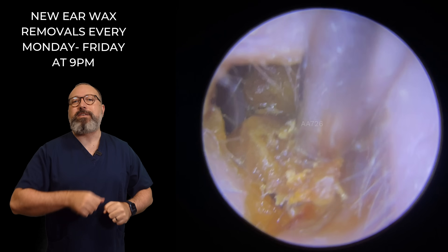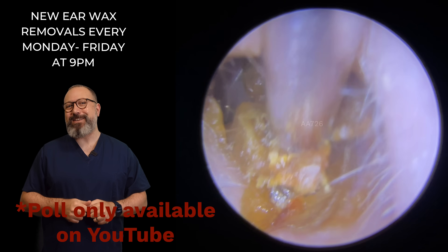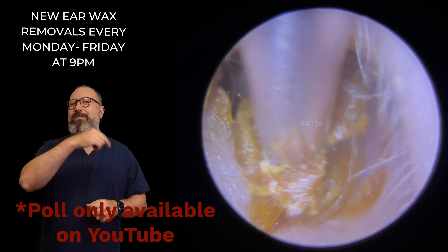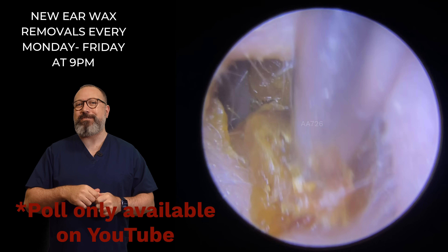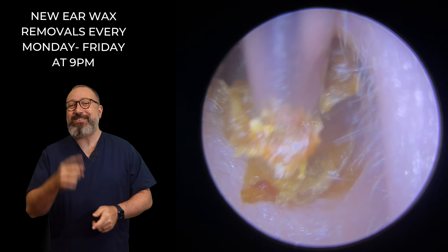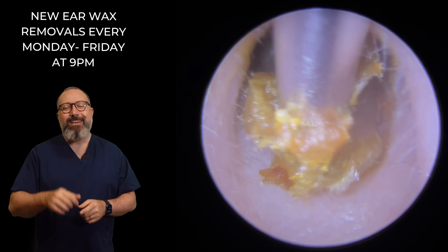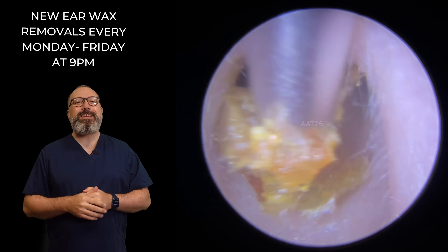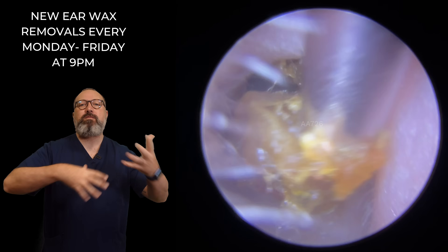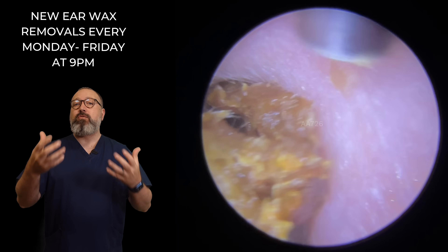There is a quiz — I've put a poll on the community section, not necessarily about what we're doing today but about what we've covered over the last two videos. Have a go at answering it. We can see here a really dry section, using a slight wiggling motion to get this out.